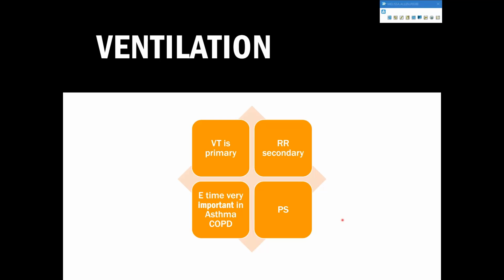So if we have a patient on a SIMV of 12 and they're breathing 20 and their spontaneous breaths are kind of small, not doing that much, by taking the pressure support up to 12, for instance, or from 8 to 10, and we take that smaller tidal volume to a bigger tidal volume, that's going to increase our spontaneous minute ventilation, which is then therefore going to increase our total minute ventilation. So it's just something to keep in mind. It's not going to be useful on every patient, but on those patients that it's relevant, it's very relevant.